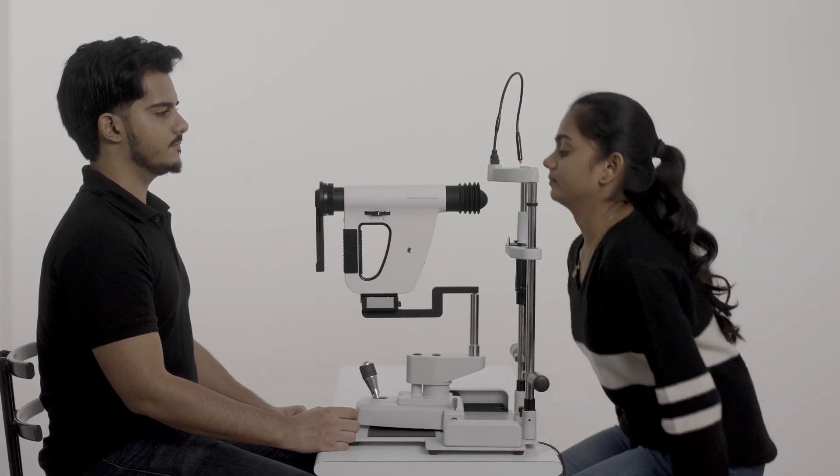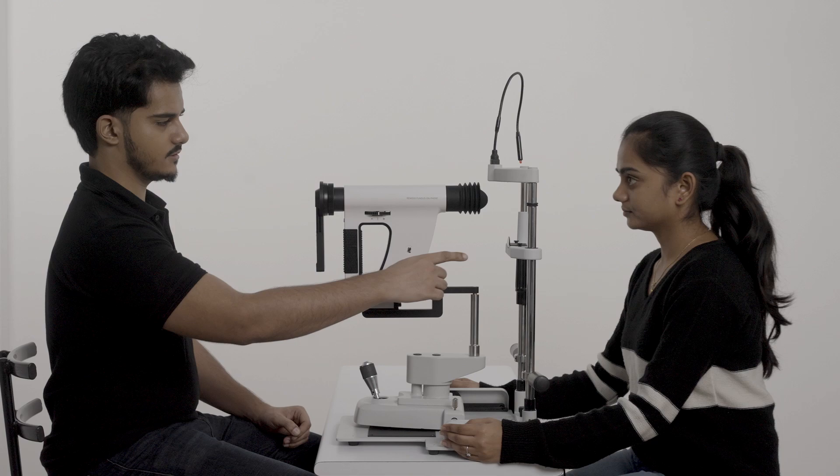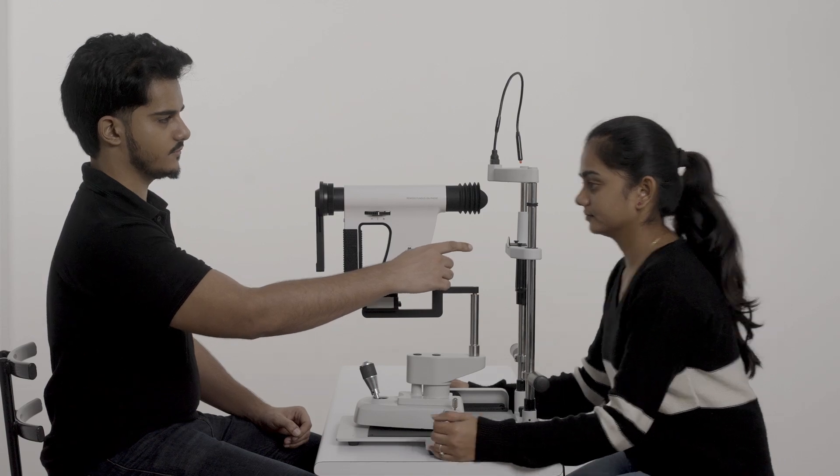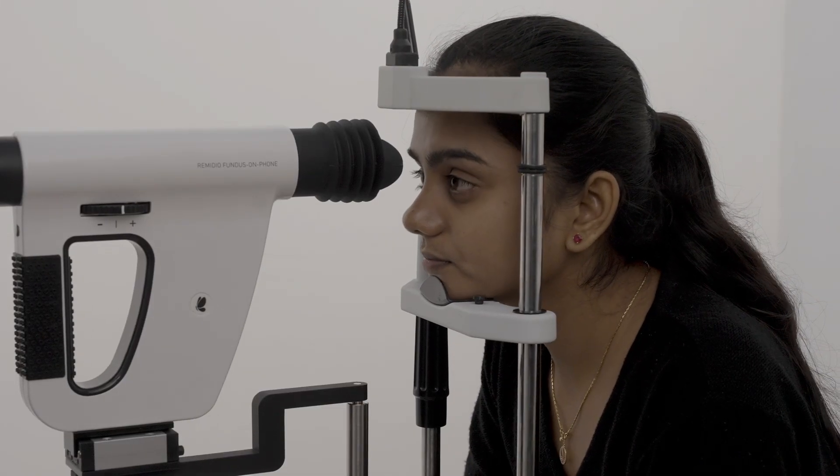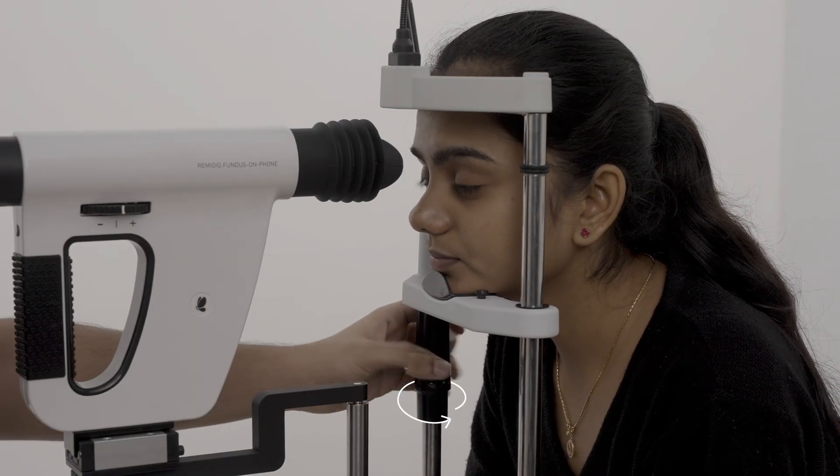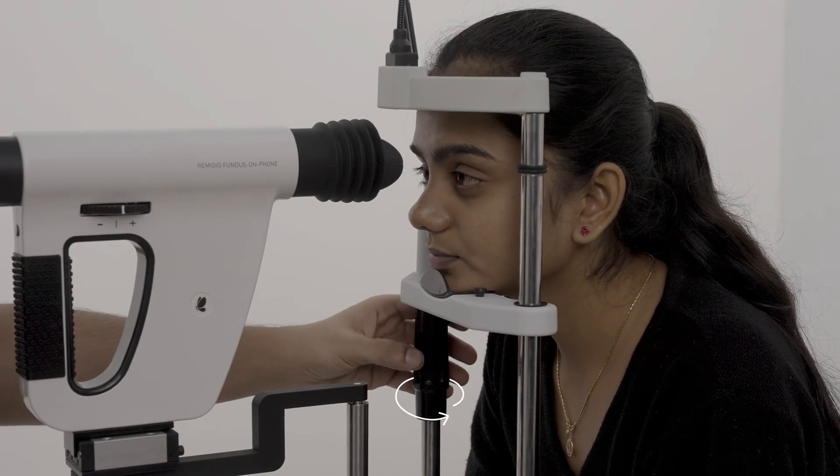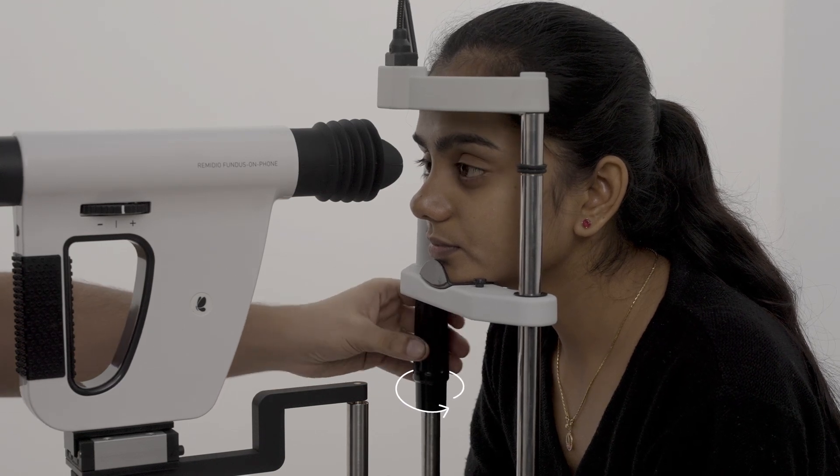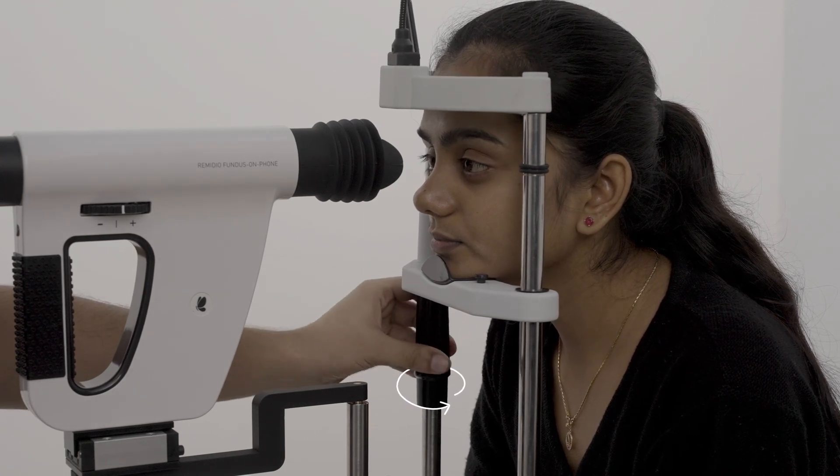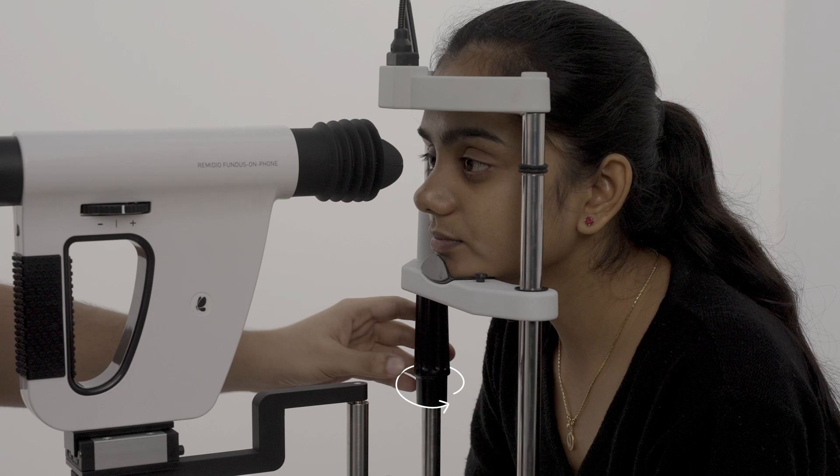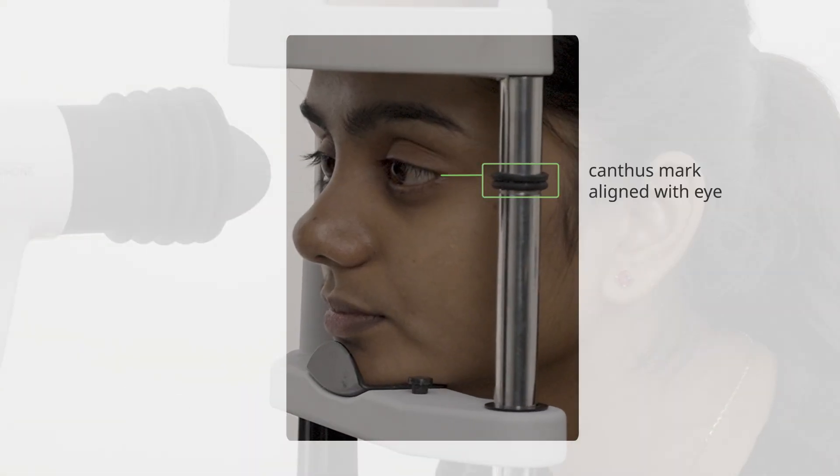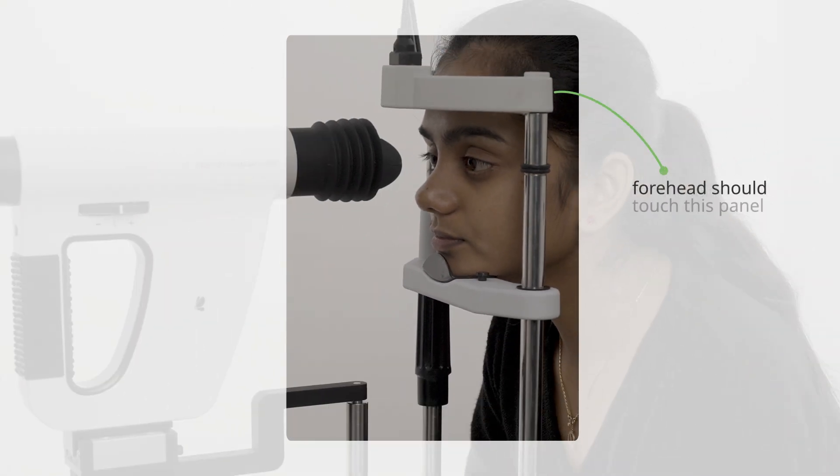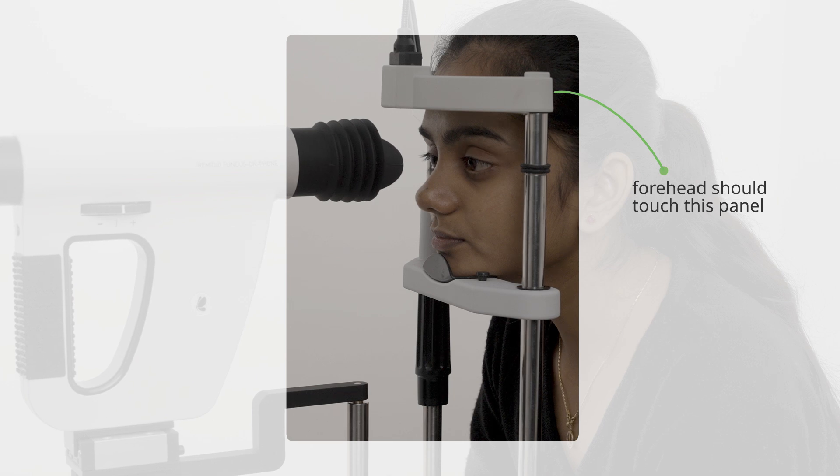Ask the patient to rest their head on the chin rest. Turn this knob to adjust the height of the eye. The eye should be aligned with the canthus mark. Their forehead should touch this panel for stability.